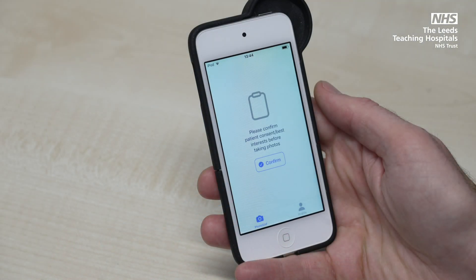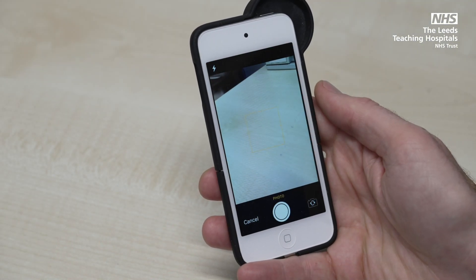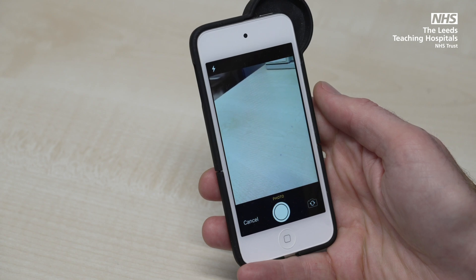Press to confirm you have gained consent for photography. Then the app will go into capture mode.